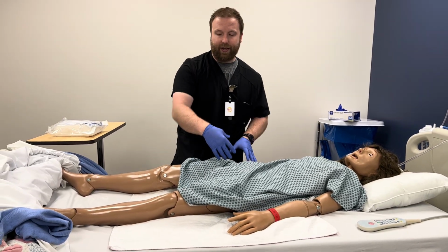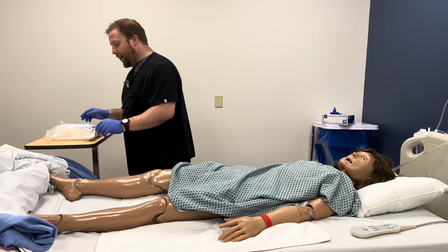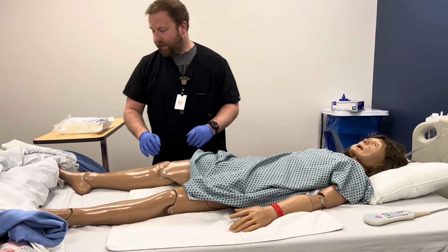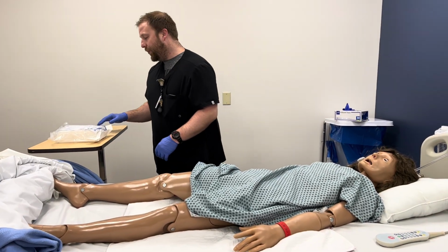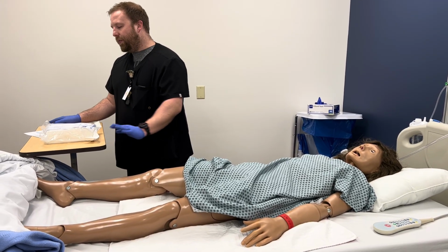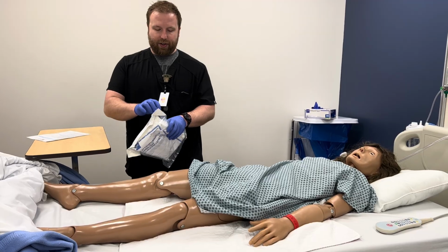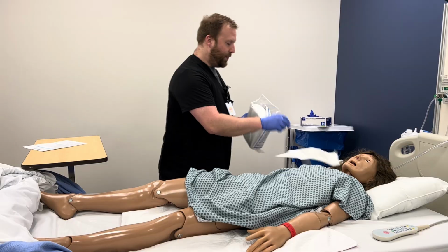I would place a blanket over here to keep them warm, but we want to make sure that our things are down here. I would want to put a waterproof pad, a little bit better than this one, under the buttocks, and then I'm going to perform peri-care with soap and water. We will have a towel and washcloth next week to perform that care. After washing, I'm going to take off my gloves, wash my hands, and I'm going to start setting up my sterile field. Many of you have already opened this by next week, but you will open this up.